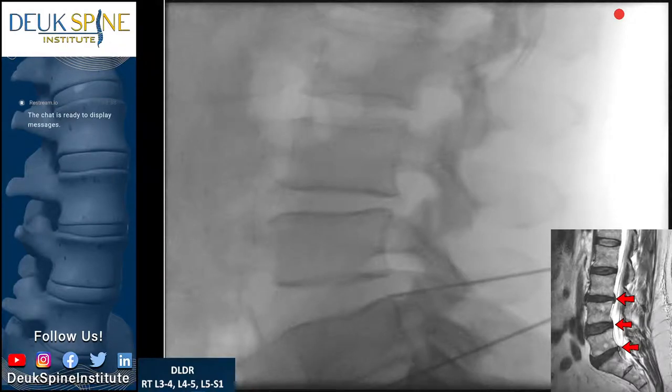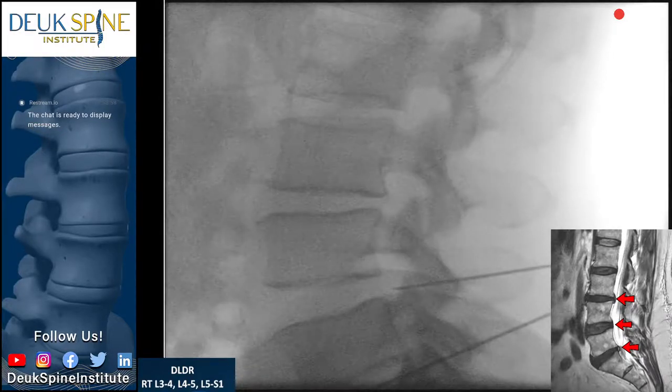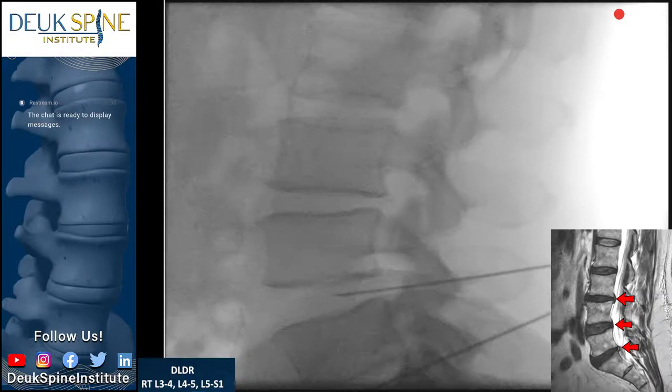I think I want to be just a little bit higher. Shot. How is he? Shot. All right, so we're a little bit higher now, which is what I want. And I can feel the herniation with the needle. Once again, this is the L4-5. And the needle went through the tear in the back of the disc where the herniation came out of. It went through it so easily. Normally, you can't push the needle in that easily into a normal disc.